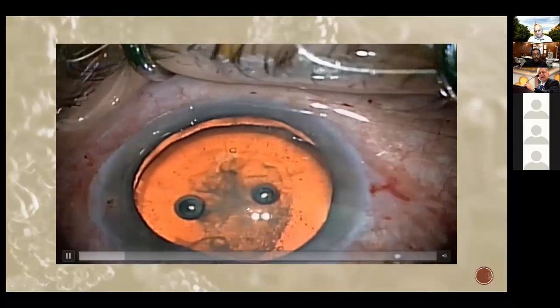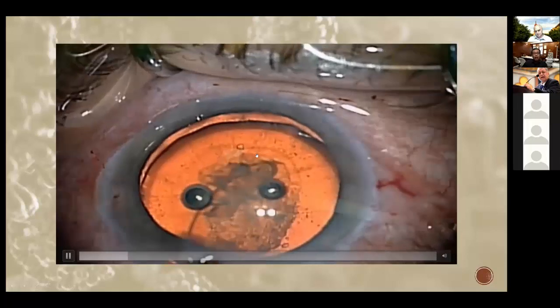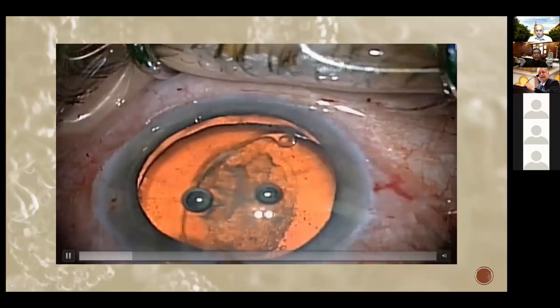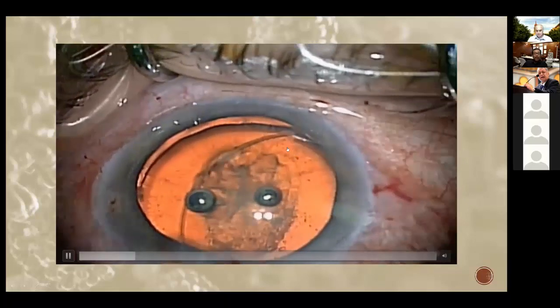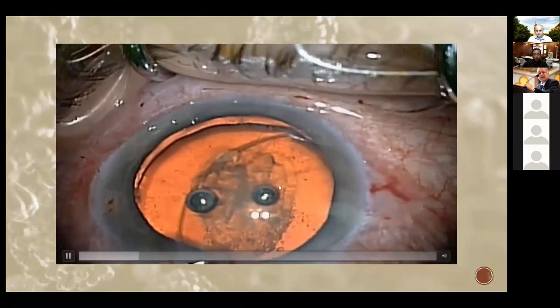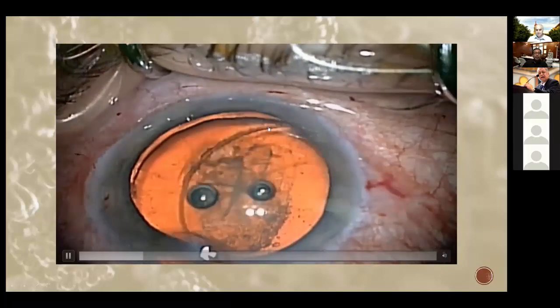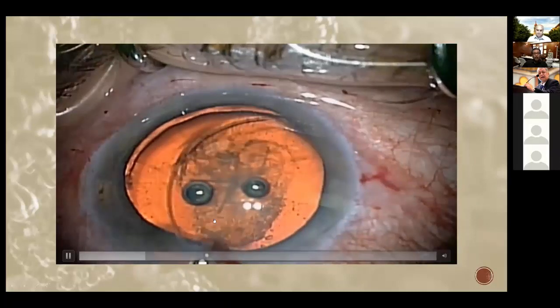Now I'm going to show some signs that are very critical when you put your CTR at the very beginning. First, you will need to put the CTR directly under the anterior capsule. And here you can see the corrugations that you have seen at the surface. It means that you are directly under the anterior capsule. When I start pushing my capsule, you will see a very nice sign, which is a clear zone between the lens matter and the end of the capsule, or the capsular tension ring.